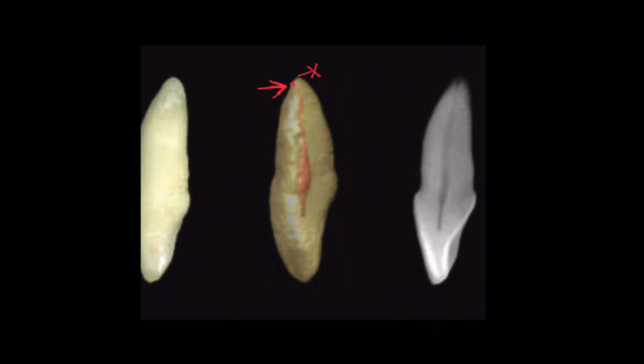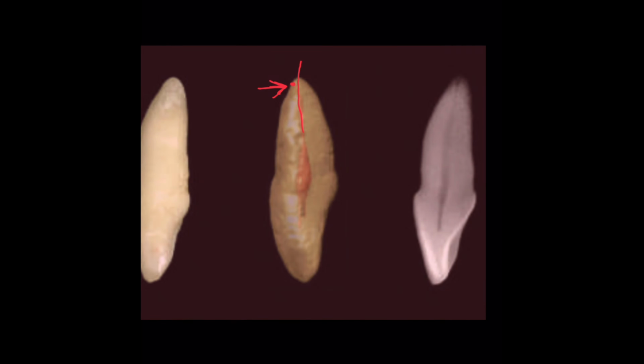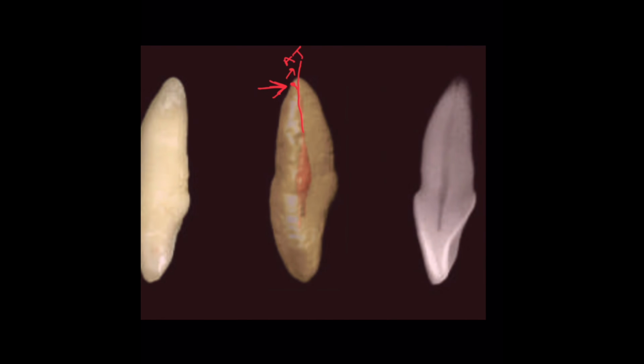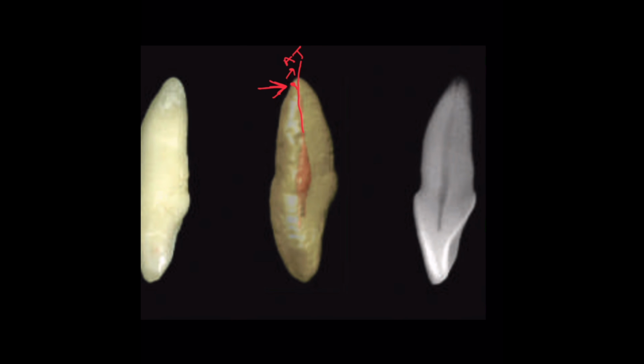If your GP is straight to the root apex in a radiograph, that means you've likely created an apical transportation of the canal. So it is always advised to obturate the GP 0.5 to 1 mm short of the radiographic apex. That way, you would not perforate and go beyond the apical foramen.